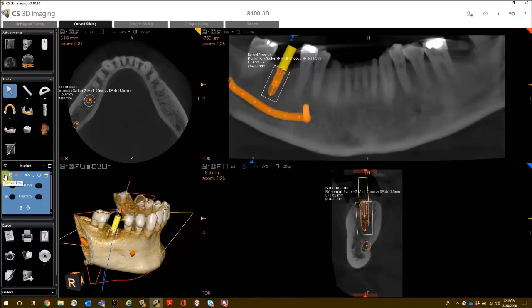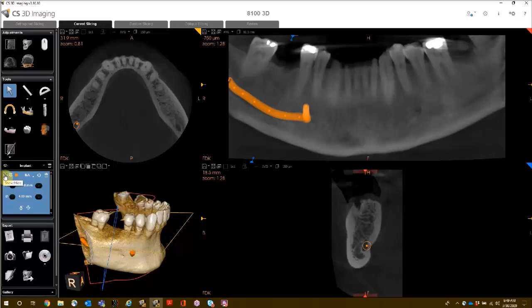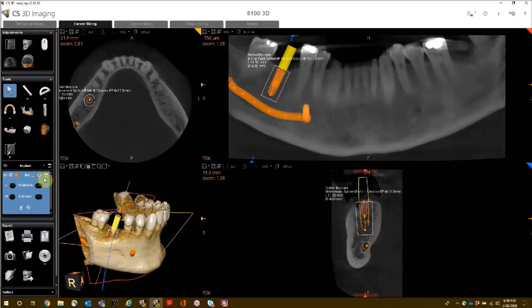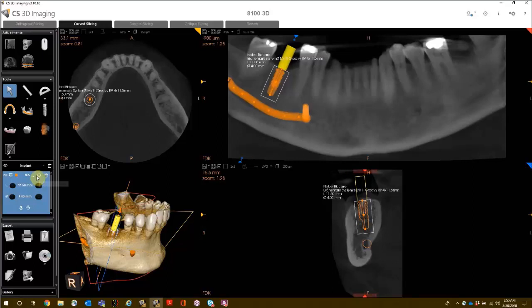The options for the implant include show or hide the implant, show or hide the object properties, change the color of the implant, delete the implant, and center on the implant. Centering on the implant aligns all three MPR views on the implant.